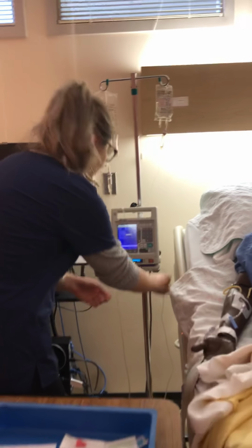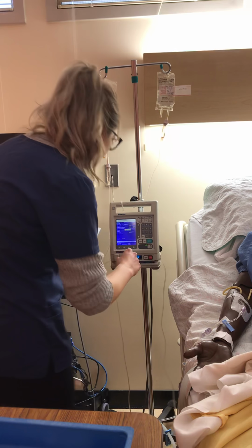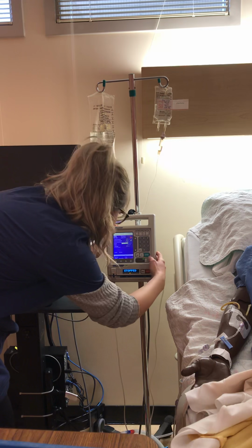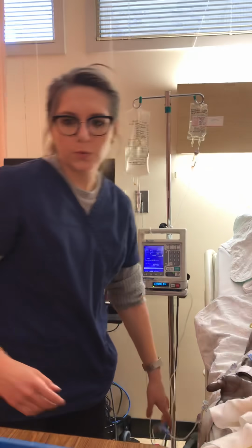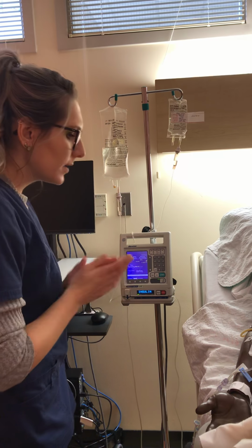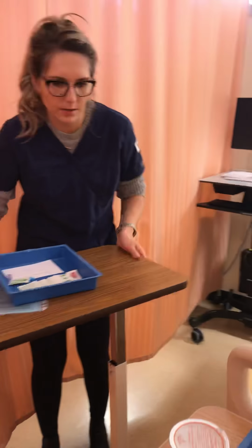So now what I'm going to do is just ensure that everything is opened. And this is still going, I can see the drips there, the vein is open, so now I can start my infusion. Okay, so now that that's running, I'm just going to wait for the 3 drips, perform my hand hygiene. I see the 3 drips going. Okay, so now we're going to start with your chest tube dressing. So I'm just going to move this out of the way here.